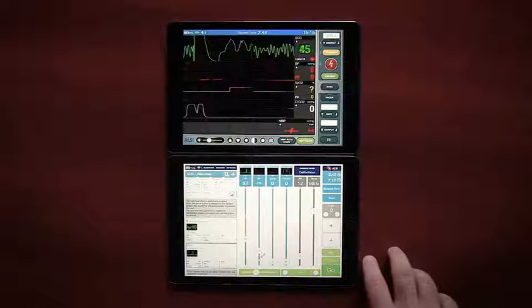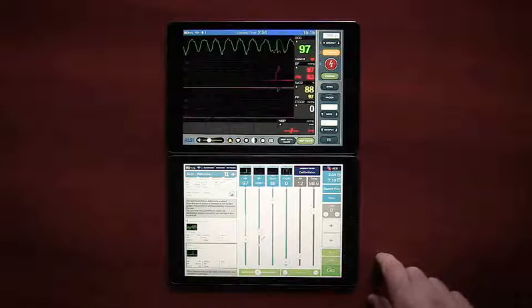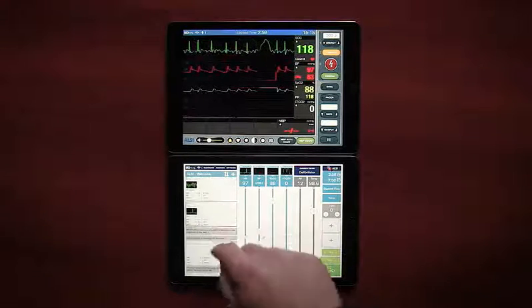The instructor can hit CPR and hide the other values, so the student's focusing on CPR. When CPR is done, we can simply push the button and the patient comes back, and we can check to see how he's doing.